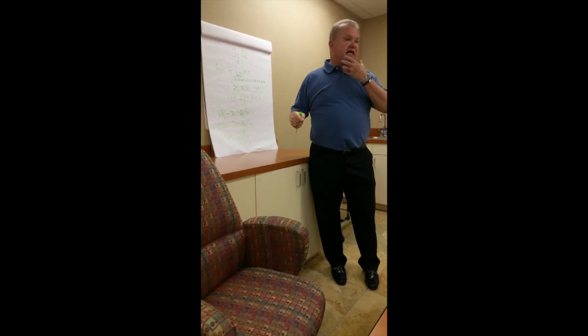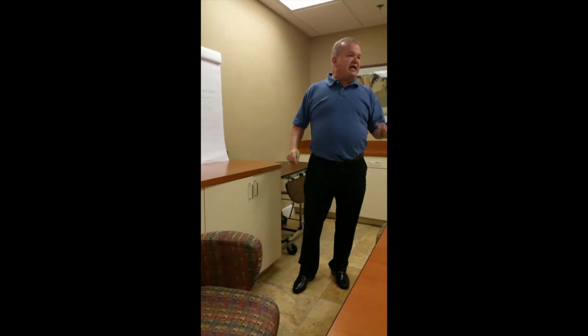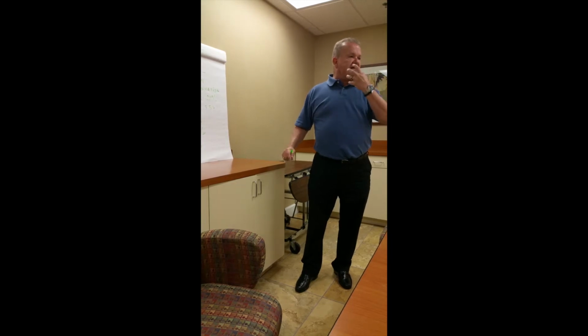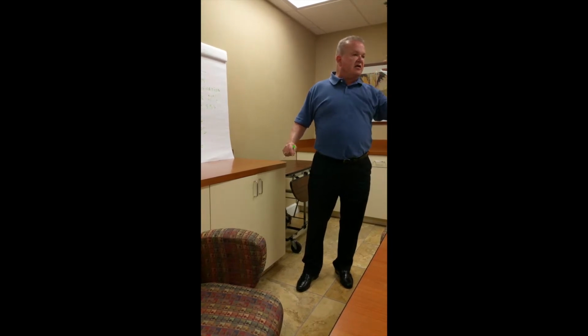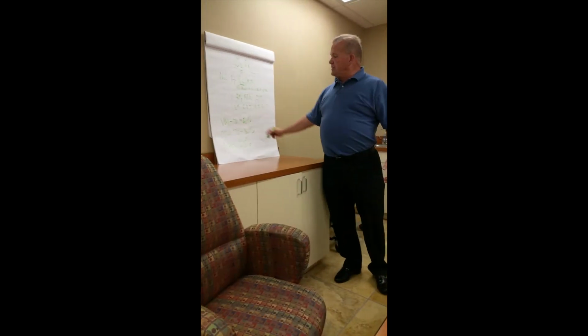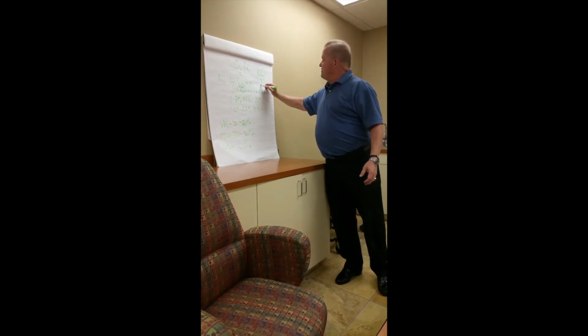You better have a good tight fit. Notice most patients, I avoid masks. Why? Unless I really need the FiO2, because most of the time they're going to take it and put it on their head, their ear. That's why the nasal cannulas are the most comfortable. Okay? So remember your FiO2 percentages. They cannot be on 10 liters. 10 liters, look for the FiO2 on the mask.